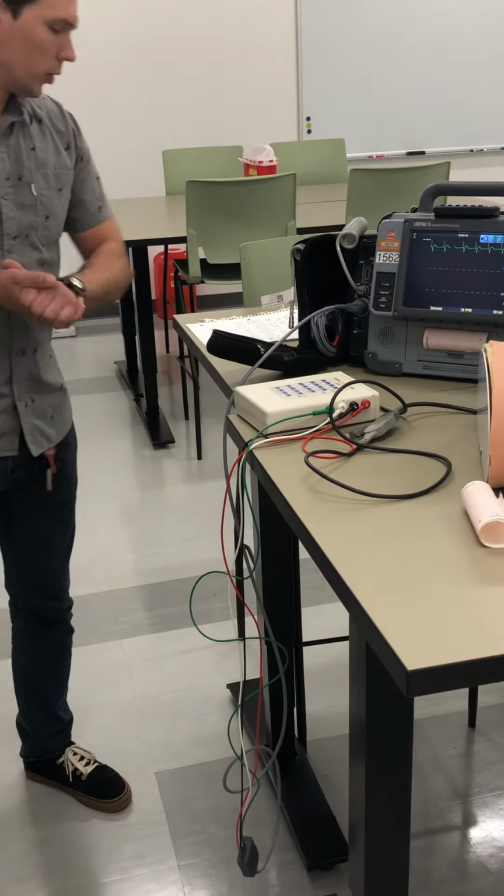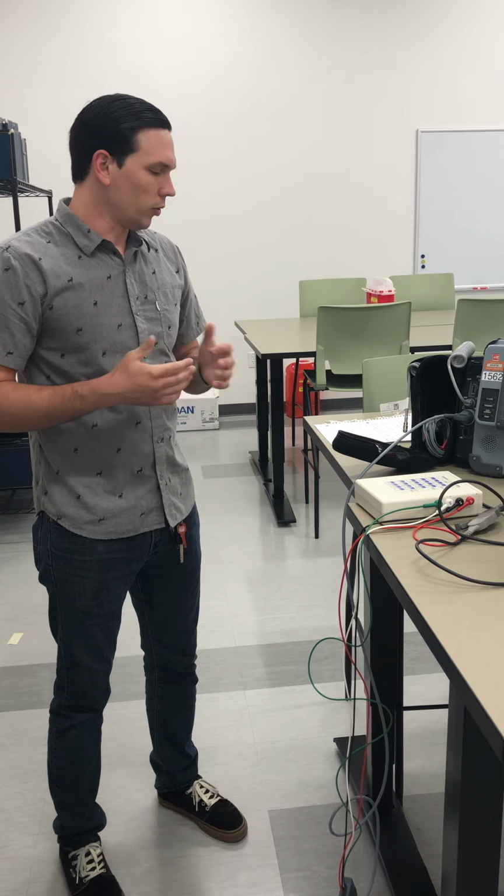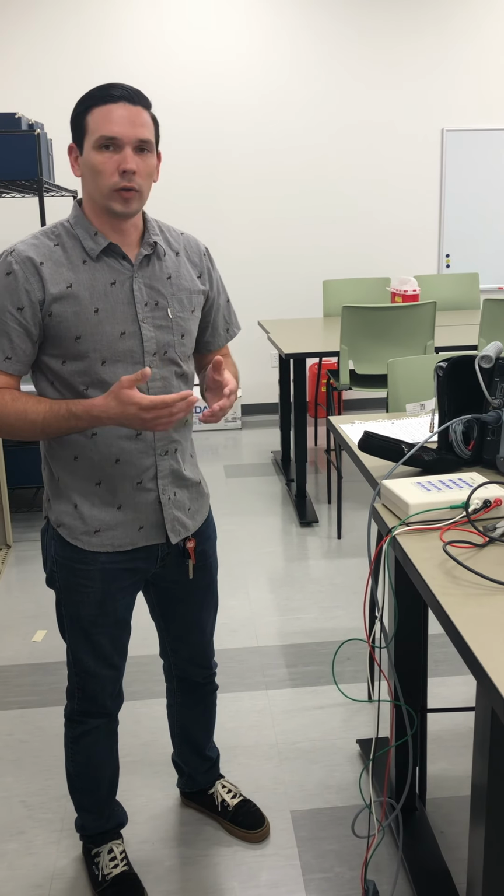One thing to remember though, when you are using transcutaneous pacing, you may have to sedate or use analgesic medications per your protocol, because this can be a painful procedure for the patient. So just make sure that you're doing the correct dosing and following your protocols.